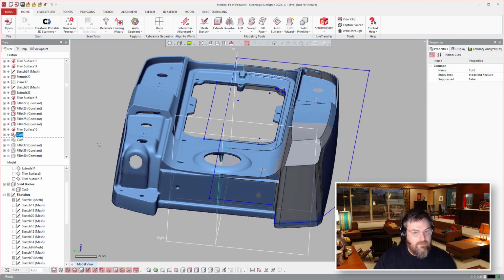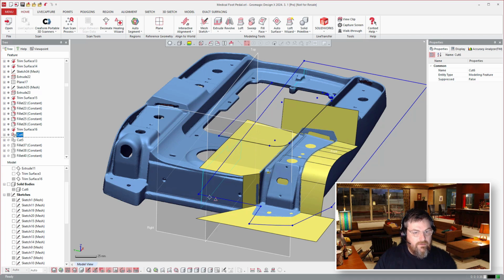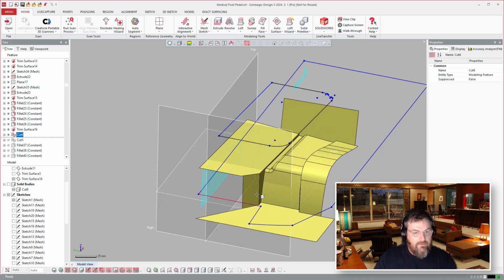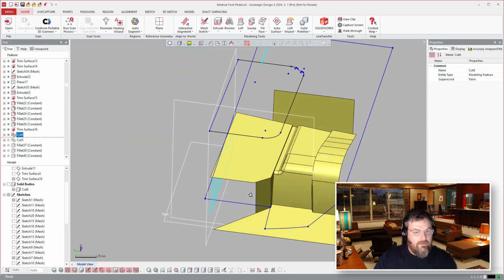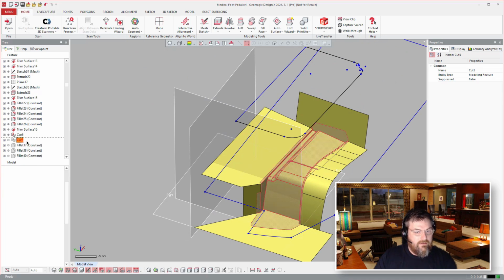All right. So we'll just turn that on. You'll see here. Turn that off. So there we are. We're getting there. And then we'll go ahead and cut this away. So as you can see, just bundling and putting a bunch of features together and creating a nice tool to work with, and then cutting it away from the solid.